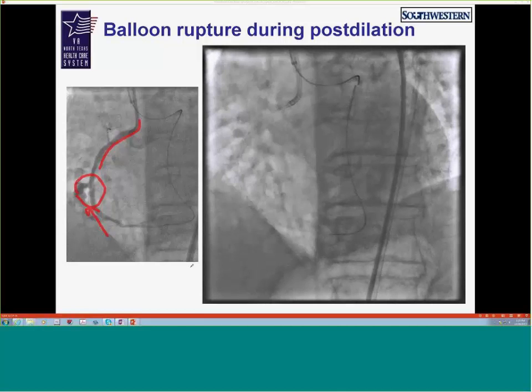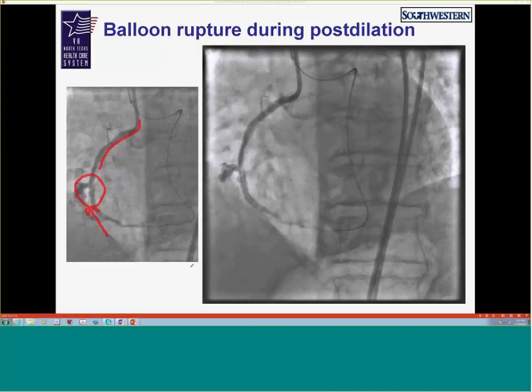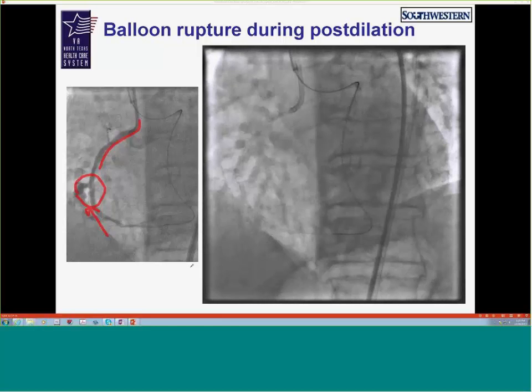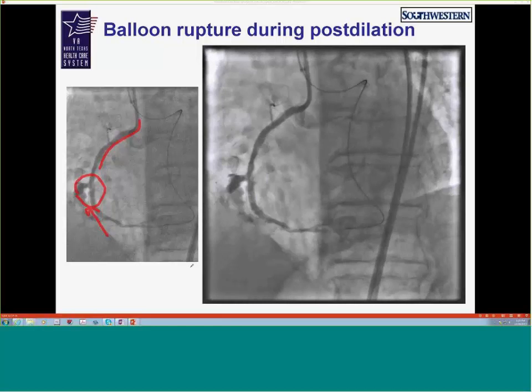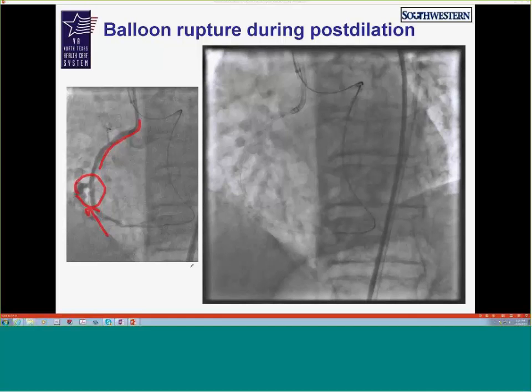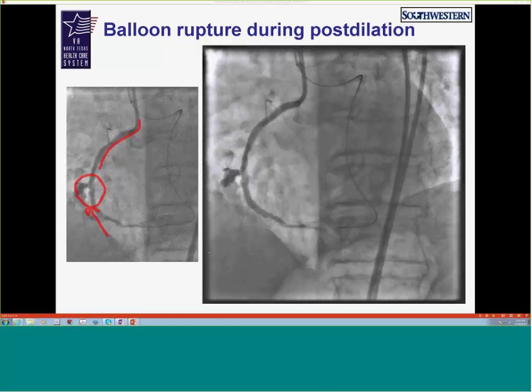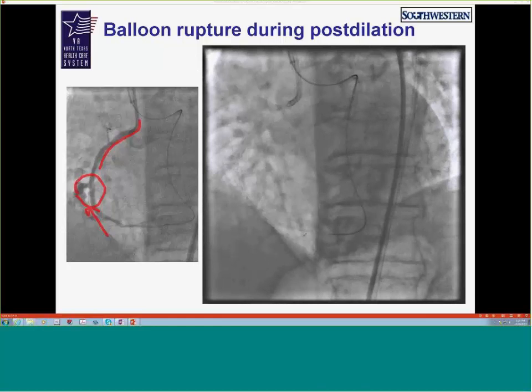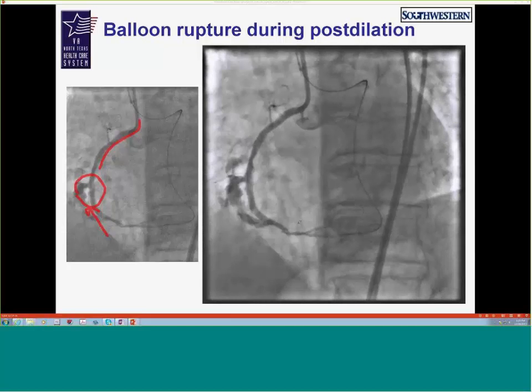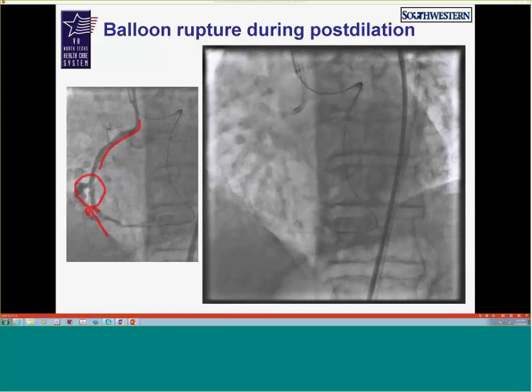Which I tried to get down, and the whole thing crumbled like crazy in the ostium of the vessel. In spite of having an externalized wire, tremendous support, we did have a lot of difficulty delivering anything from the beginning, but the stent was destroyed within 5 seconds. Great. And that's our only cover stent. Not good. So yeah, not good. I would agree.